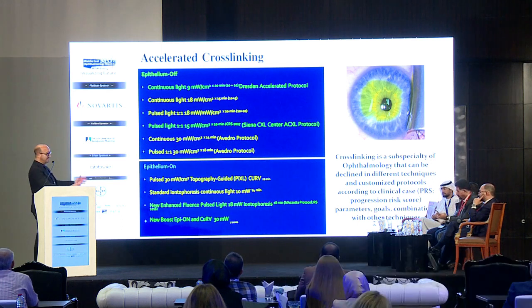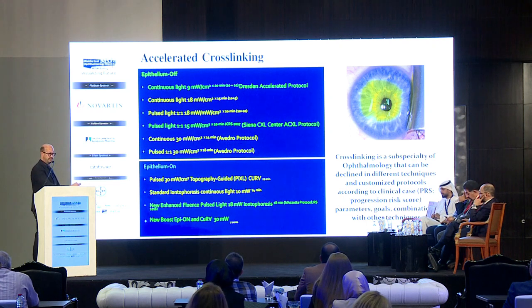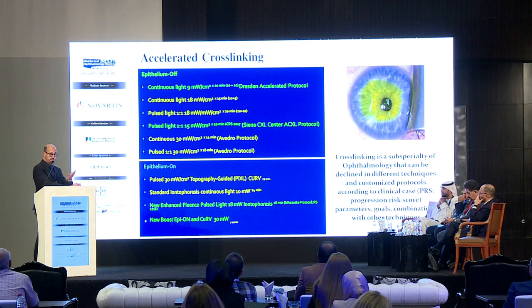And we have the pulsed light 18 milliwatt. You can do the cross-linking in 10 minutes of soaking and 10 minutes of irradiation, 20 minutes instead of 1 hour. Pulsed light 15 milliwatt, 30 milliwatt with continuous and pulsed. Of course, we have the Epi-on with iontophoresis riboflavin loading, and without iontophoresis, and with supplemental oxygen and without.